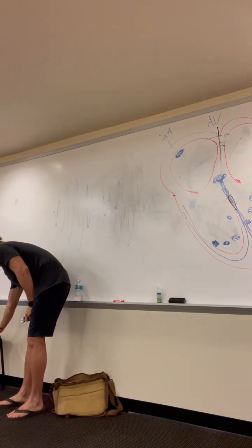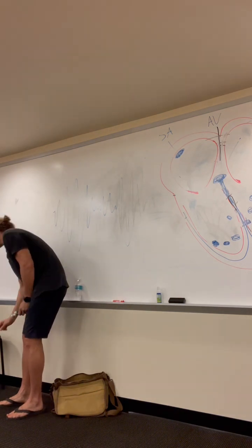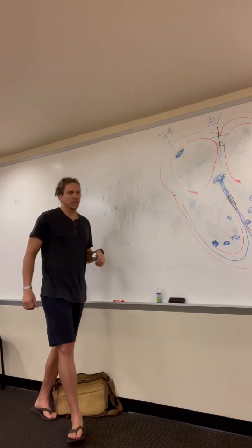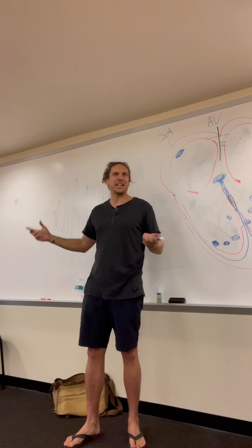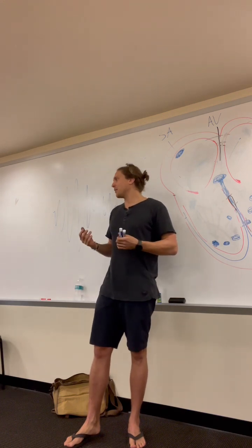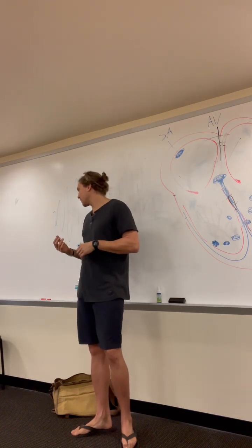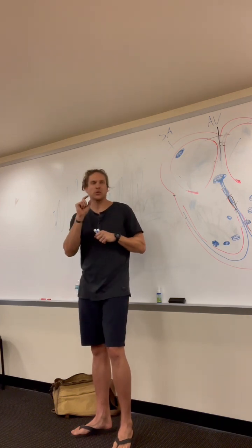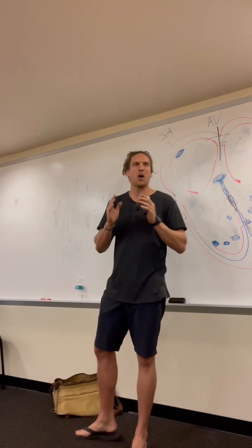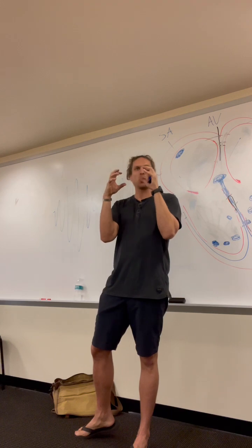Next slide, 17, is ventricular fibrillation. Now, if you look at this, there is a little bit of twisting in this rhythm, but it's not adequate, or these electrical rhythms wouldn't actually be able to make the heart pump. These are small, it's more like a twitching.